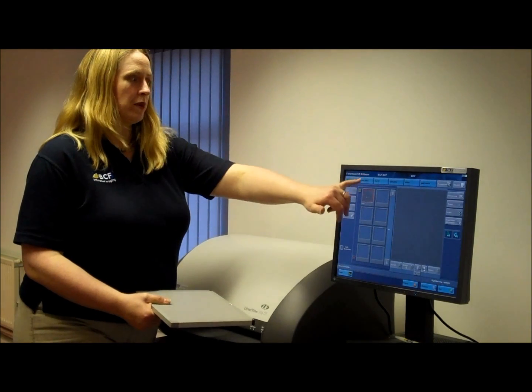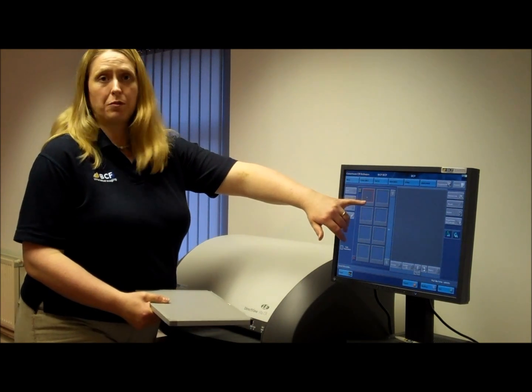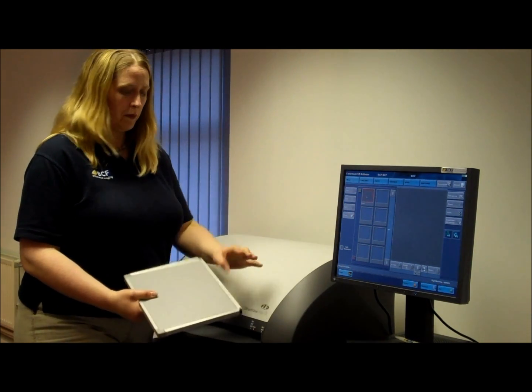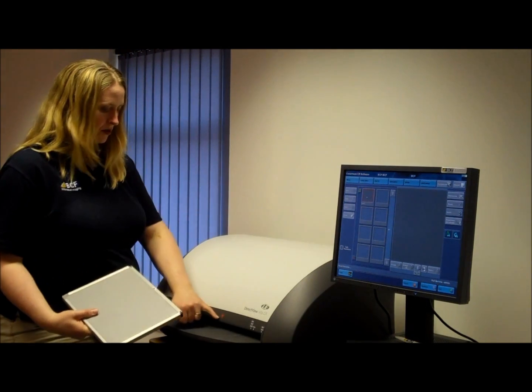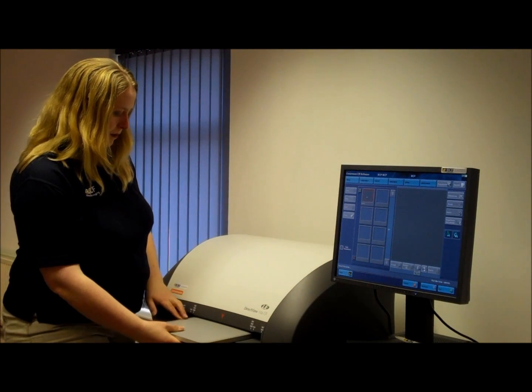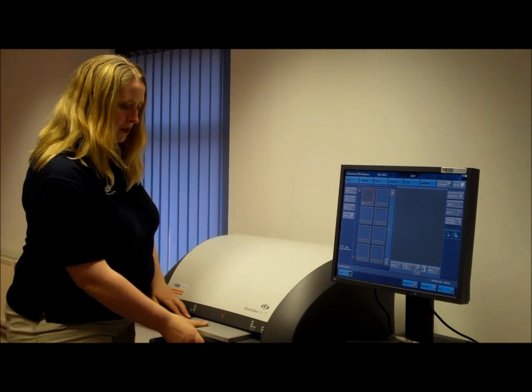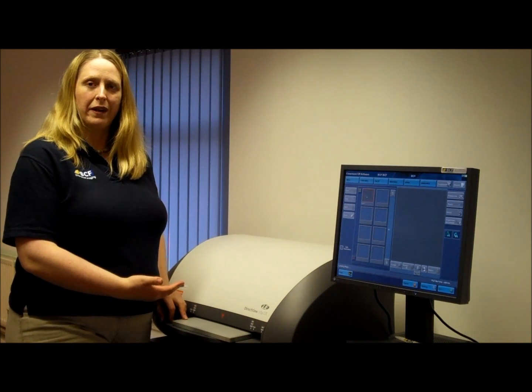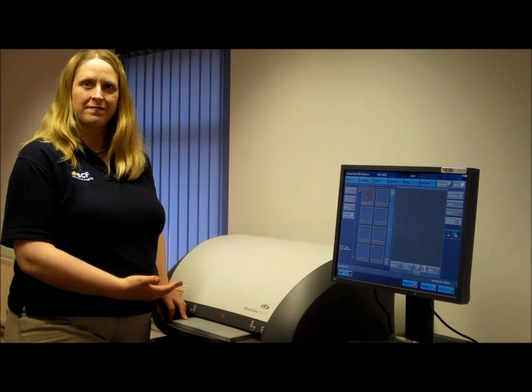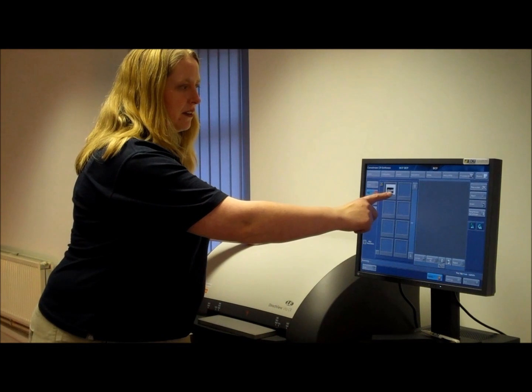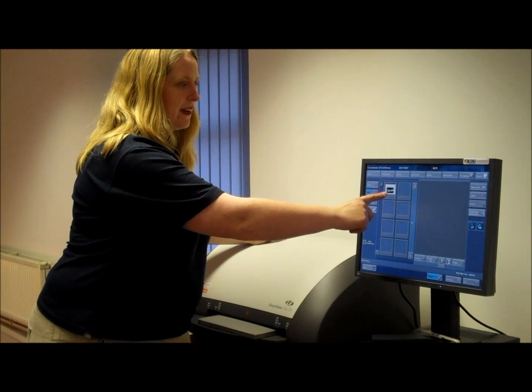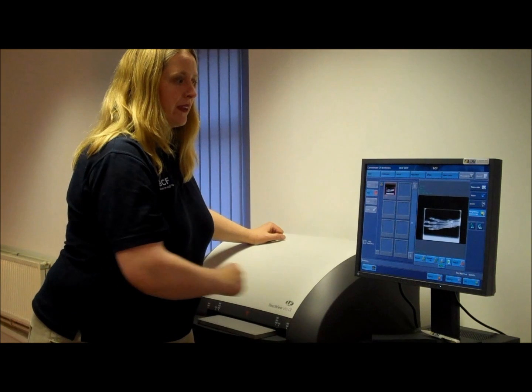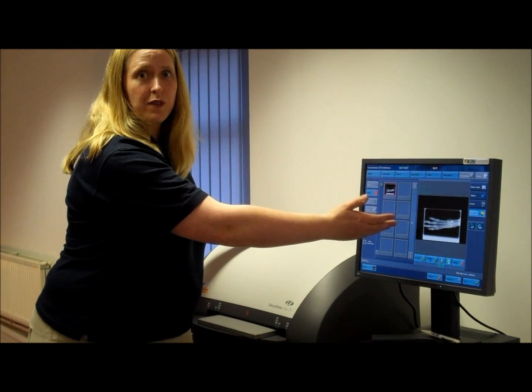Once you've chosen your body part and made sure that your projection's highlighted, all you need to do is input your plate — red arrow to red arrow — and simply push it in until it stops, and then give it a little shove, and the machine will start processing the plate. Your image is now starting to appear, and in a moment this will load into the main screen. And here's your first shot of your image.